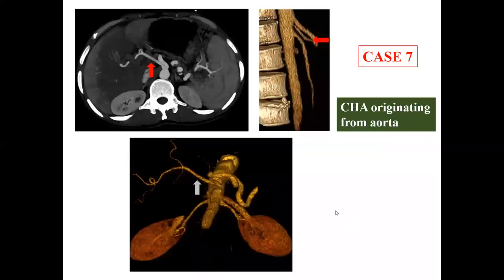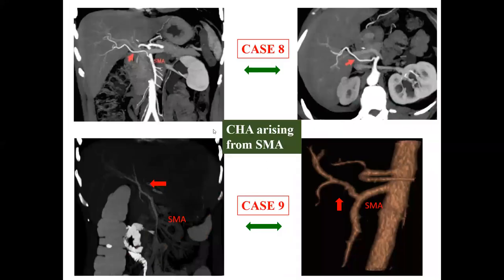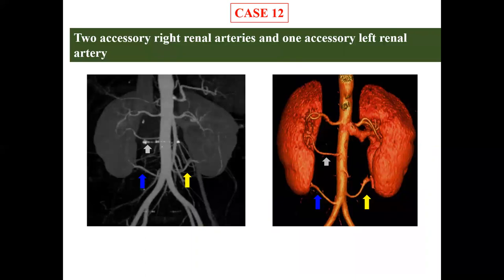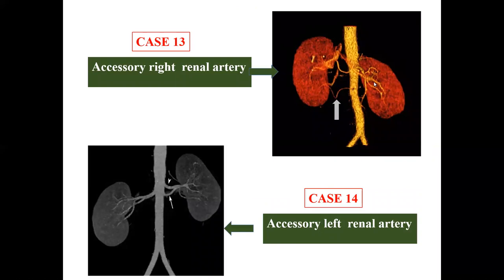In case 7, a common hepatic artery originating from the aorta is demonstrated, also shown on volume rendering CT. In case 8, the common hepatic artery is seen arising from the SMA, also demonstrated in case 9. Cases 10 and 11 show the right hepatic artery originating from the celiac trunk, while case 11 also shows the right hepatic artery originating from the aorta. In case 12, two accessory right renal arteries and one accessory left renal artery are noted. Case 13 shows an accessory right renal artery and case 14 shows an accessory left renal artery.